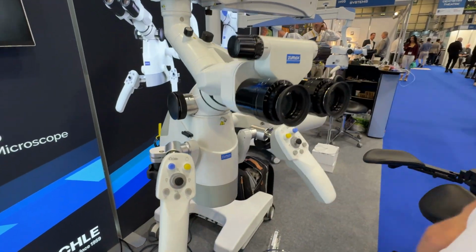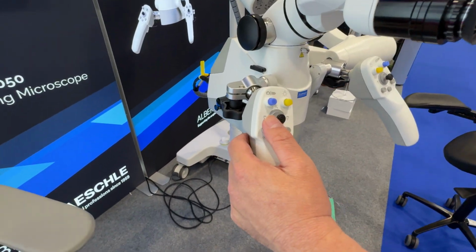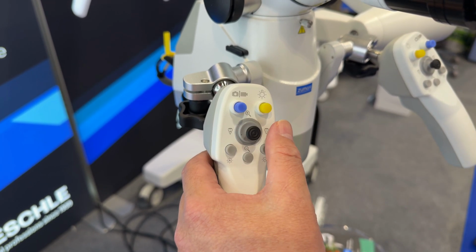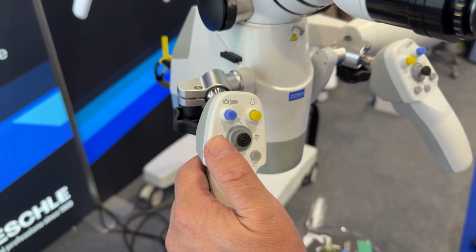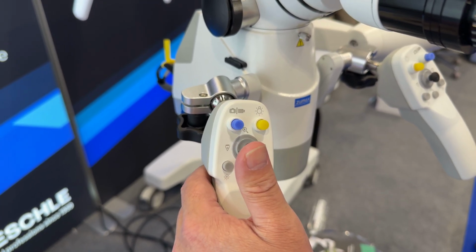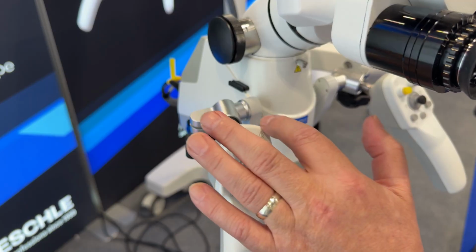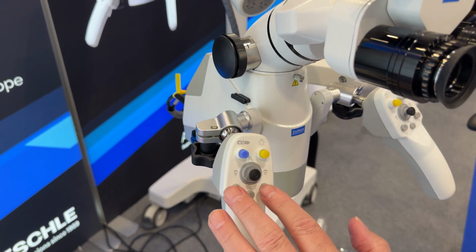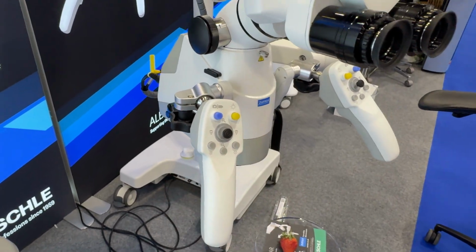And then your controls are on these handles here. What you've got on these controls, if you're able to see them, is the magnification. You can increase your magnification by going up, decrease it by going down, and you've got your variable focus by going across to that side or across to that side, and you have roughly a foot, 30 centimeters of variable focus in this machine. Then this blue button here with the camera image, you press that once and you've taken a photo, you hold it down and you've taken a video, and these buttons here control the light output. You press the plus and it gets brighter, press the minus, it gets dimmer.